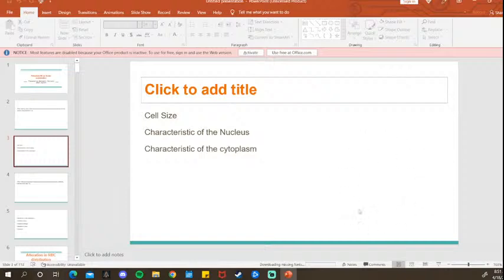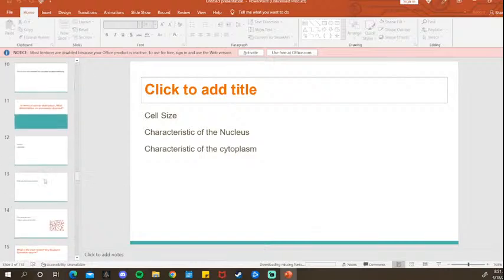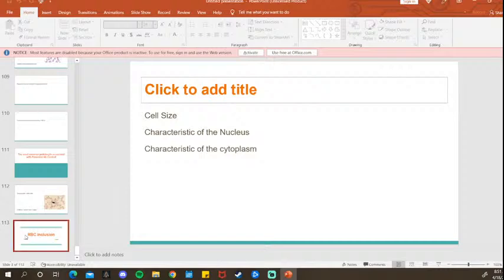While in megaloblastic anemia, you're going to see hypersegmented neutrophils, and in our next discussion, you're going to see hypersegmentation, hypersegmented neutrophils.